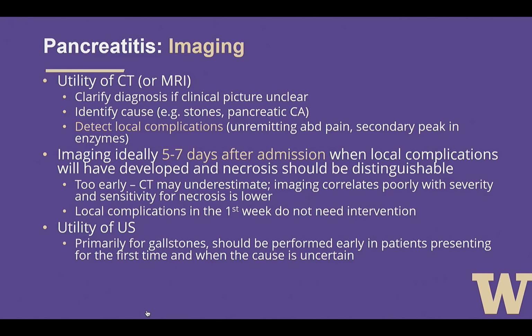Ideally, we would perform the imaging 5 to 7 days after admission. This allows enough time for local complications to develop and for us to be most sensitive, distinguishing between necrotizing and non-necrotizing pancreatitis. If you image these patients too early, the risk is that CT will underestimate the severity. But that being said, many of these patients do get imaging early. There is also a role for ultrasound, particularly early and in patients who are presenting for the first time with pancreatitis, specifically looking for gallstones.